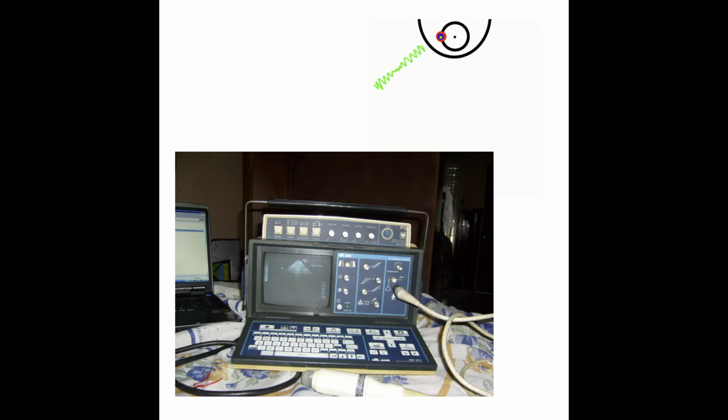So again, the annular array transducer is basically obsolete at this point, but it shows us how we have now moved to an array transducer, still using the mechanical part of it, but are advancing in our understanding of lateral resolution, elevational resolution, and how to create the entire field of view.